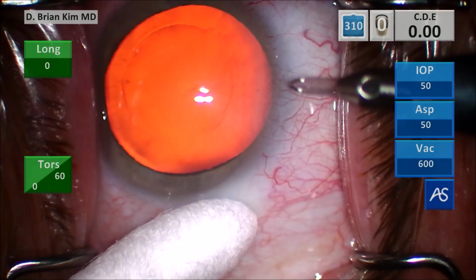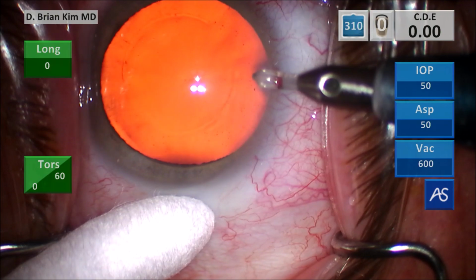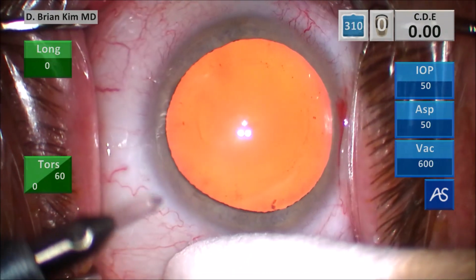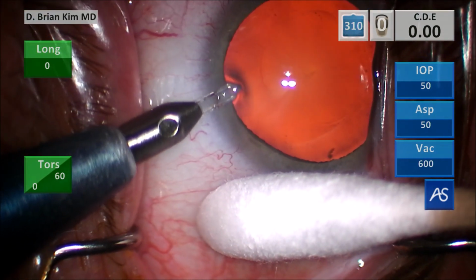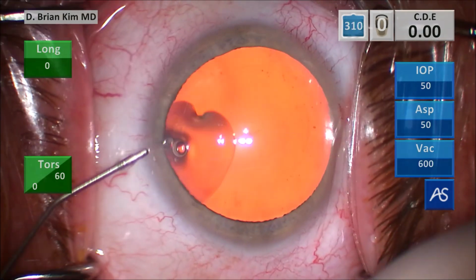Asking the patient to look to the left, holding the eye still with the cotton tip, trying to get a nice flat approach for my paracentesis incision. Do the same thing on the other side, having the patient look towards the right of the screen, getting a nice flat approach, which will create a nice corneal shelf and allow me to achieve a self-sealing incision.